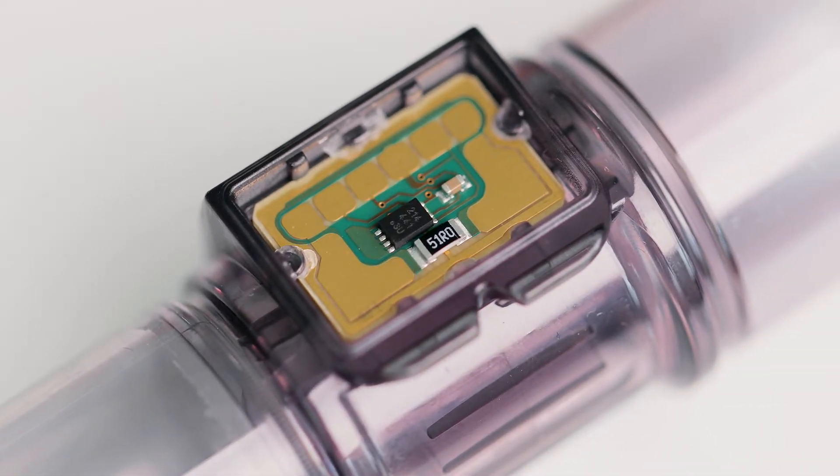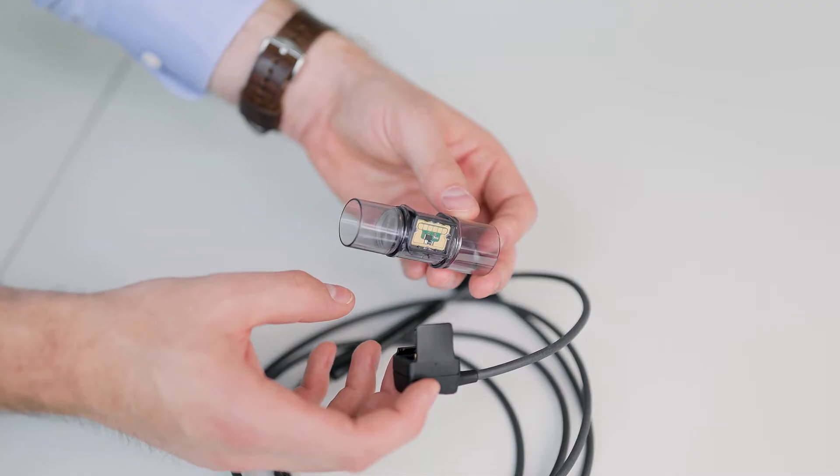The answer to these challenges is the Sensirion SFM3200AW sensor. It withstands up to 30 autoclaving cycles or can be cleaned using Cydex or Sterat. We've also fitted it with standard medical cones and grooves for a clip-on connector cap.